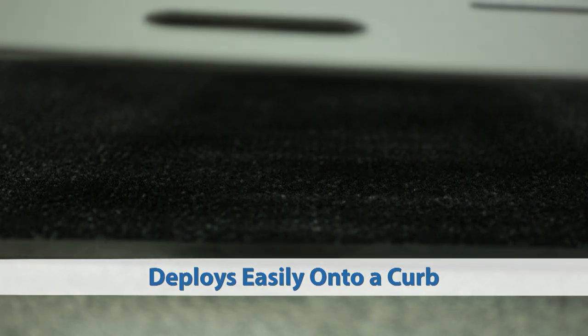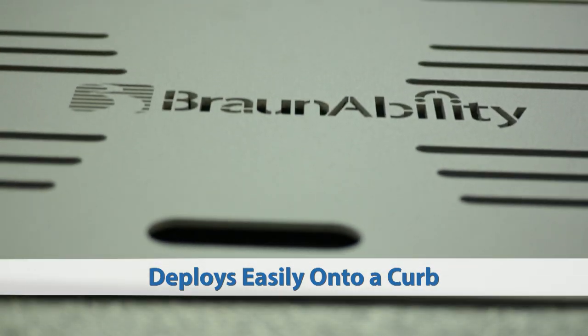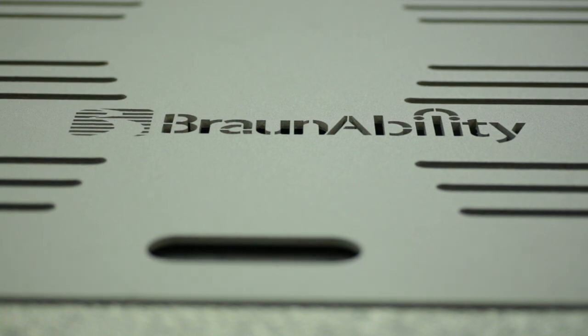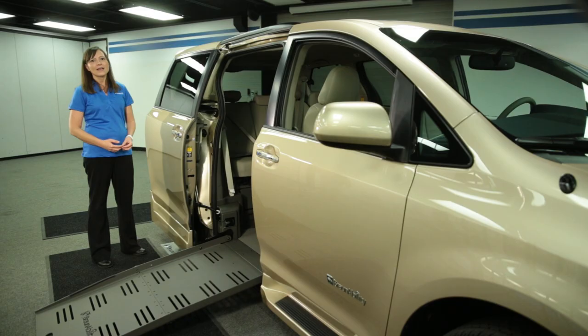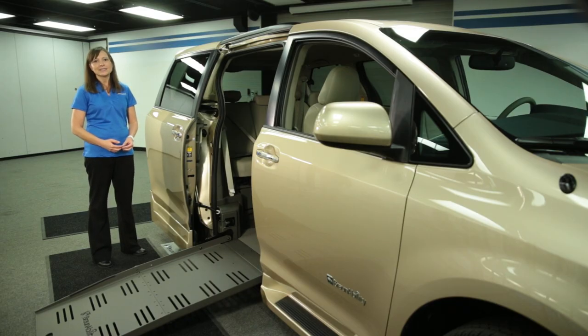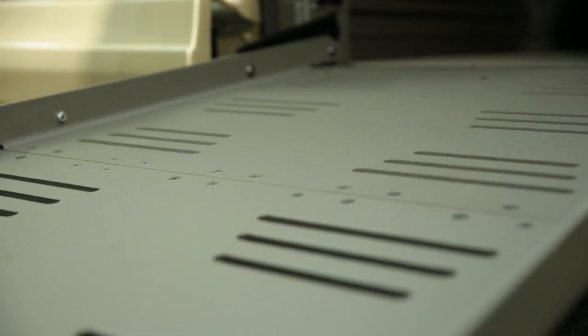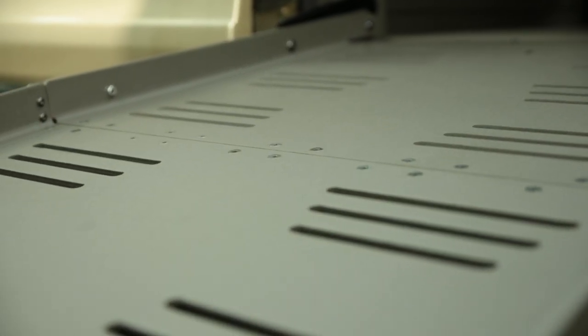As wheelchairs continue to increase in size, weight capacity is very important. That's why our fold-out ramp is tested and approved at an 800 pound capacity.